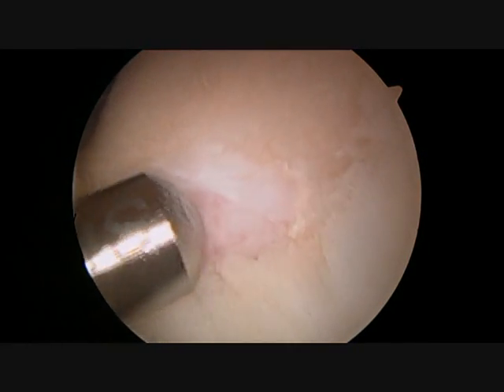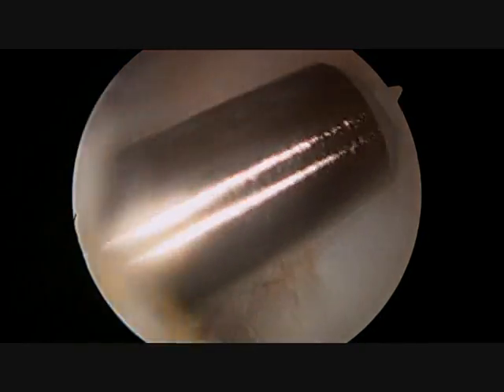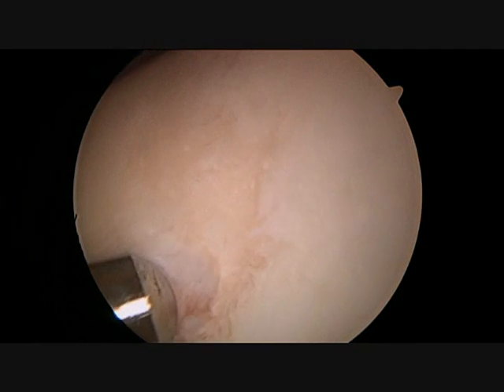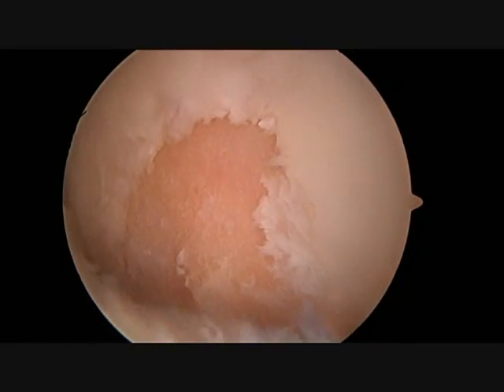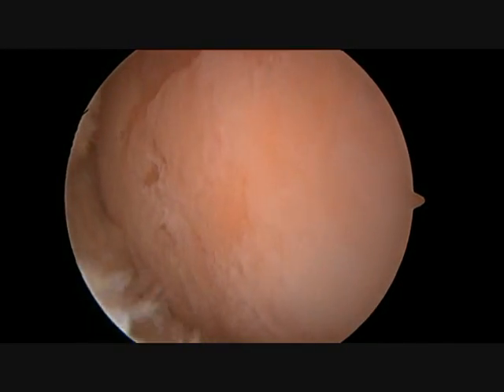Returning back to the medial side of the knee, I find a large amount of loose debris, large craters and potholes. I used the shaver to perform a chondroplasty, which smooths out the rough surface. The goal is to smooth out the country road as much as possible, but the only way to truly resurface this road and make it smooth is with knee replacement.